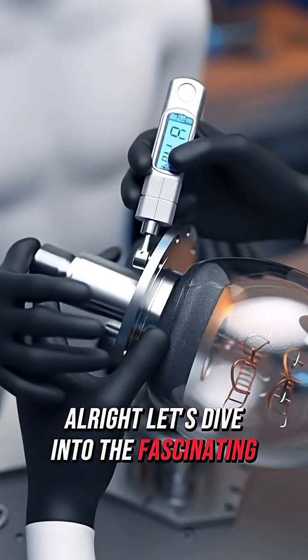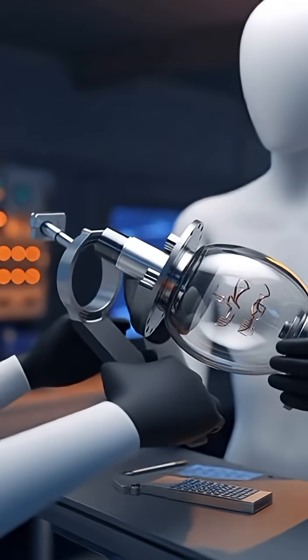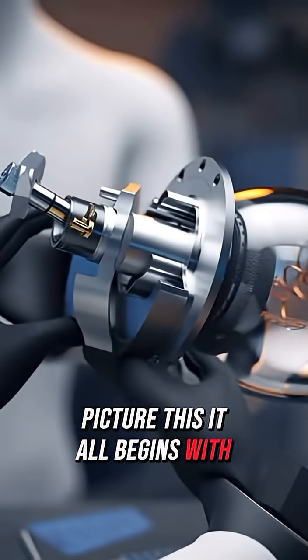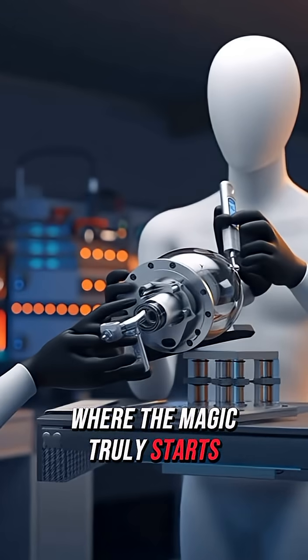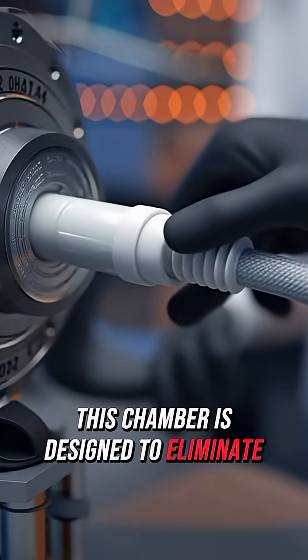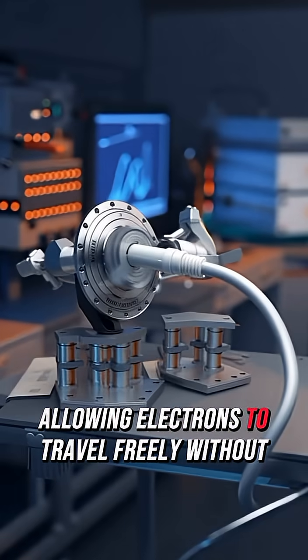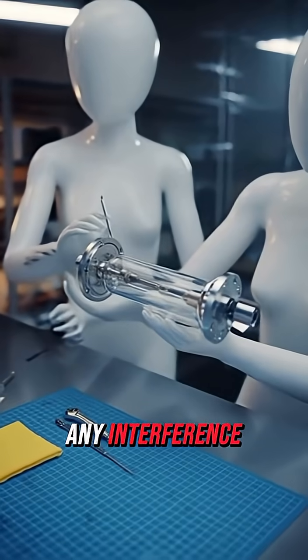All right, let's dive into the fascinating world of X-ray tube production. Picture this: it all begins with the creation of a vacuum chamber, where the magic truly starts. This chamber is designed to eliminate air, allowing electrons to travel freely without any interference.